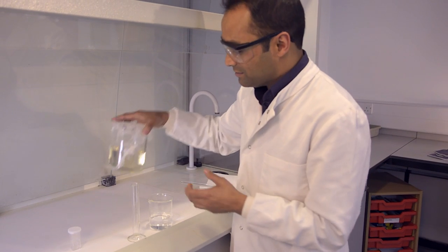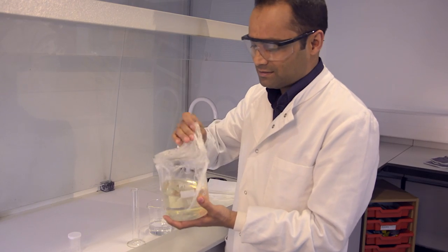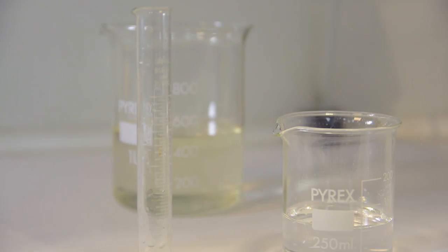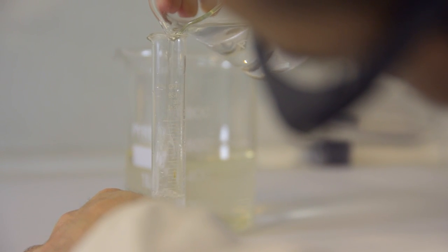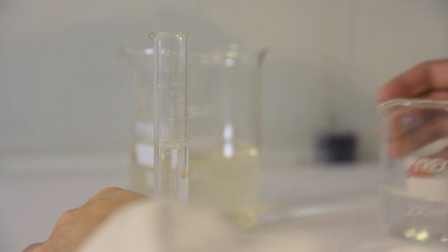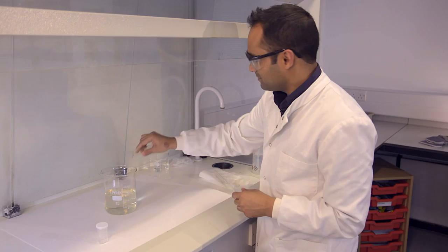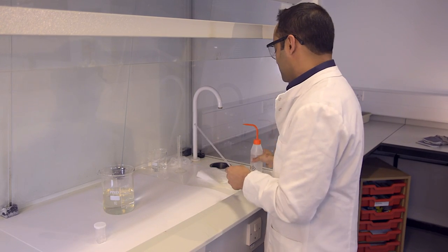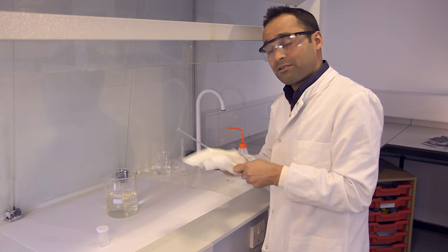This is my agar solution and it's cooled down enough so I can handle it, but it's still quite warm to the touch. I'm going to add my disinfectant solution and give this a stir with a glass rod, which I'm going to clean with some alcohol just to make sure it's sterile.